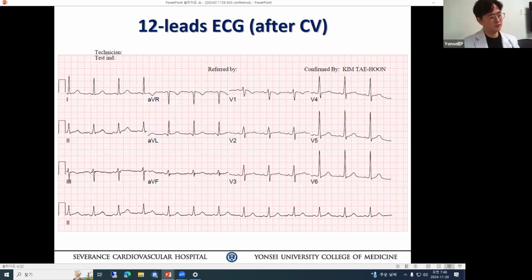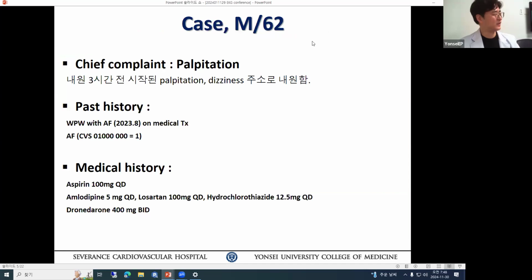It depends on the patient's age. I missed the patient's age. How old is he? 62. 62.